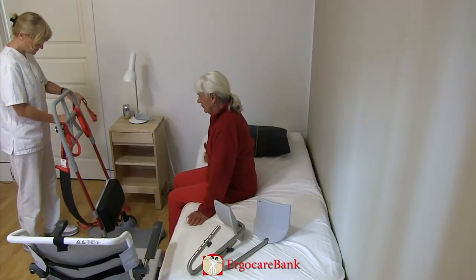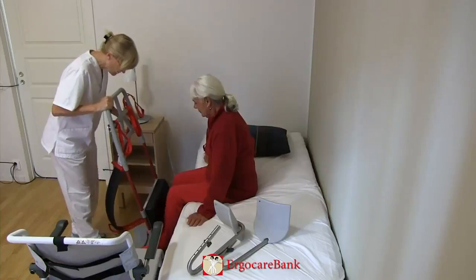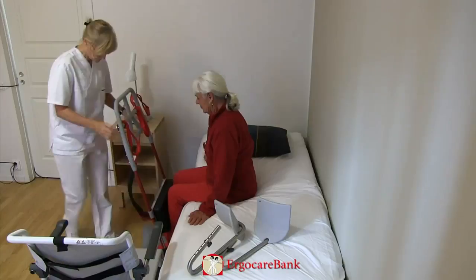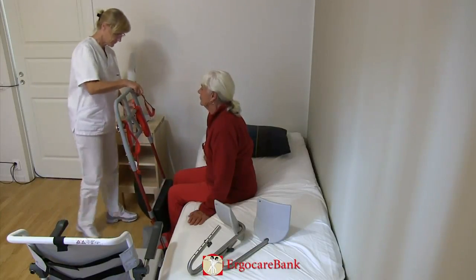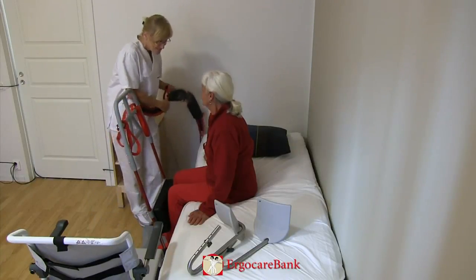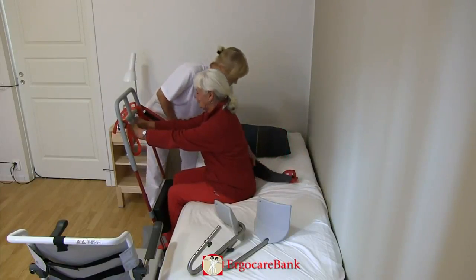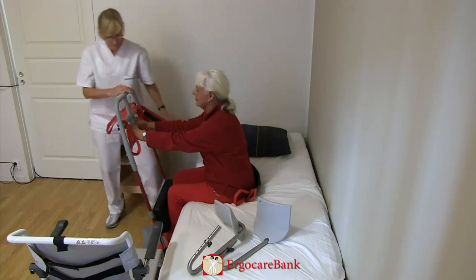Celia is instructed to put her feet on the platform of the Raizer. The brakes of the Raizer are locked. The belt is attached to one side of the Raizer and put behind Celia's lower back, and Celia is instructed to grip the handles of the Raizer.